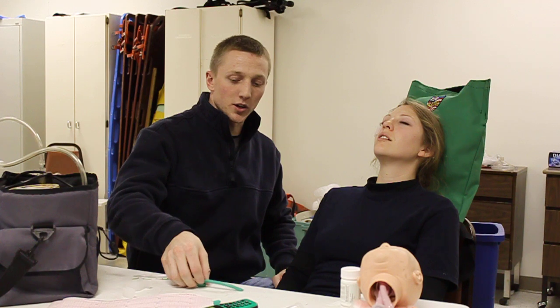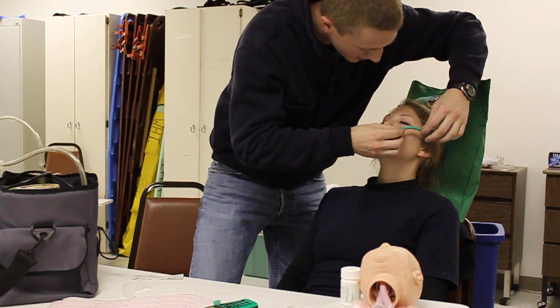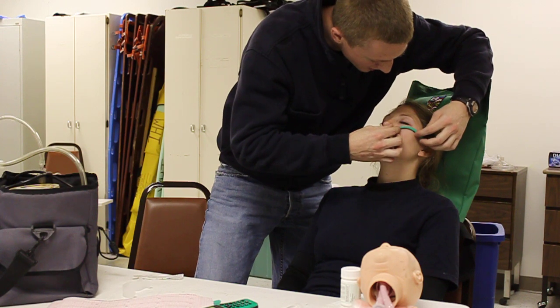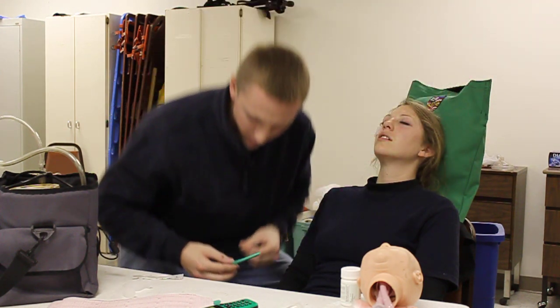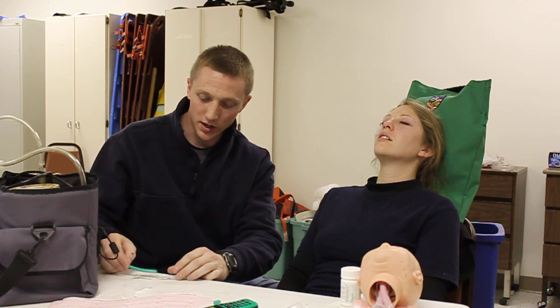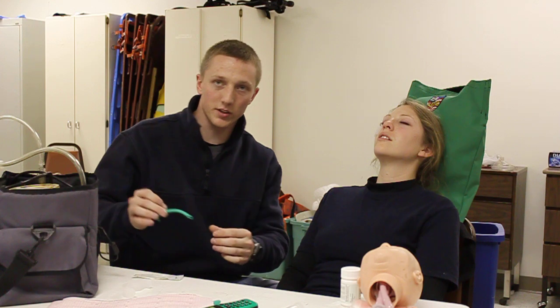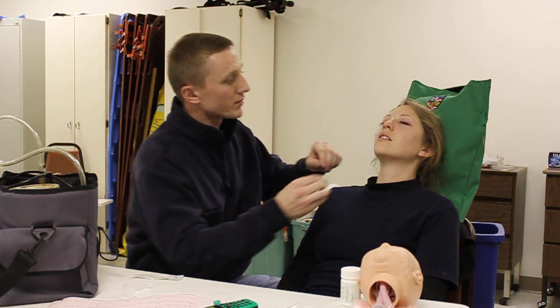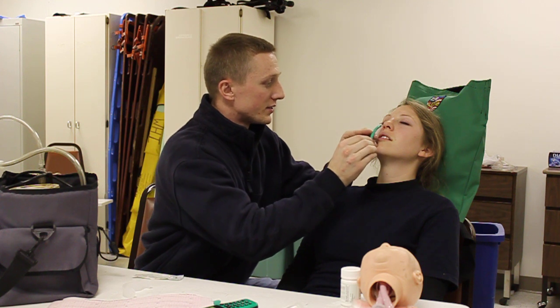I need you to go ahead and insert a nasopharyngeal airway. I'm going to go ahead and choose an NPA, measure the NPA from the corner of the nose up and over the cheek to the earlobe. Once I have the NPA measured, I'm going to go ahead and use water soluble lubricant. With the bevel towards the septum, I'm going to go ahead and insert the NPA.